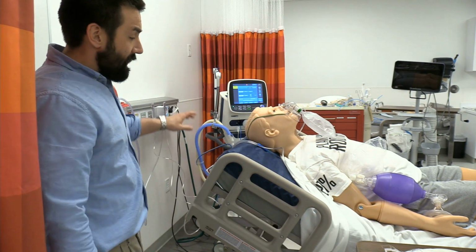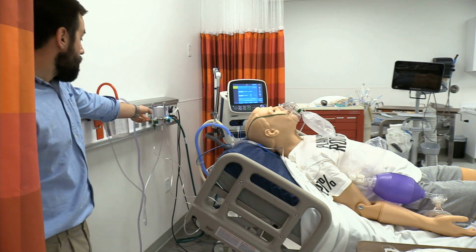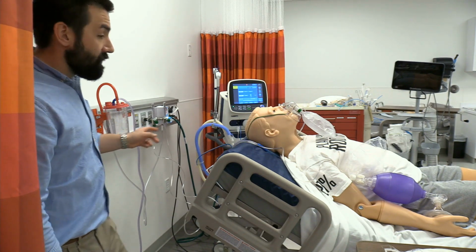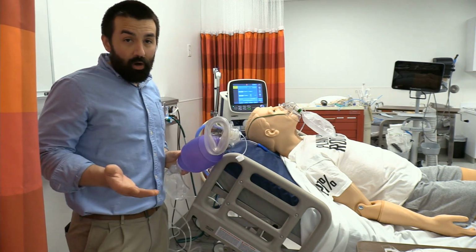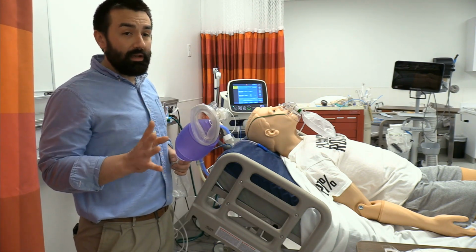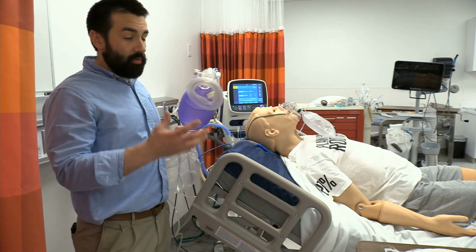Couple of other things that I got going on before I get into the equipment here. You can see that I have 2 flow meters and a 50 psi Y adapter here. That's preferable. I have one hooked up to a manual resuscitator with the mask, as well as one to the non-rebreather. You can get by with just one, but the problem is going to be remembering to switch over. So if you have the possibility, always try and make sure you have 2, both of them hooked up, 15 liters and ready to roll.